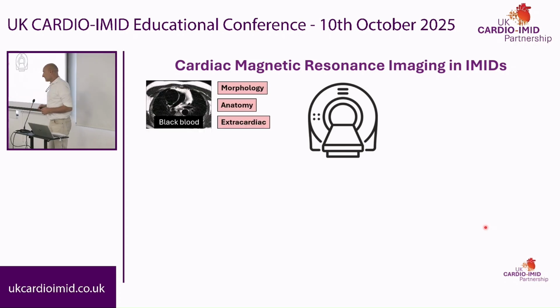So one of them, the bread and butter thing, and that's what MR imaging 25 or 30 years ago was, just anatomical pictures. So still images of anatomy. And it's still really useful. Every MRI scan today will include an anatomical overview that you look through for extra cardiac findings. You look at the size of the aorta, you look at the general anatomical correlations. It used to take like 10 minutes to get one picture when MRI first started. Now it takes a fraction of a second, but it's still part of every scan.